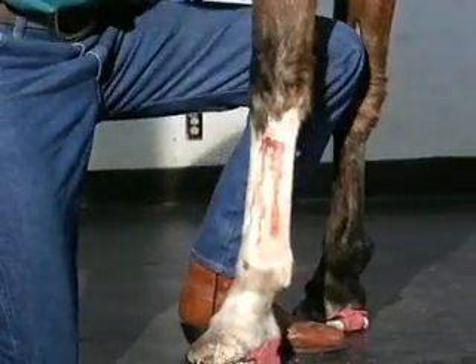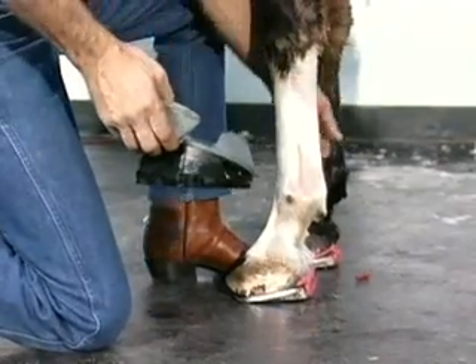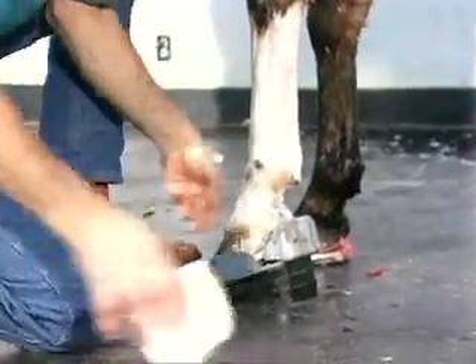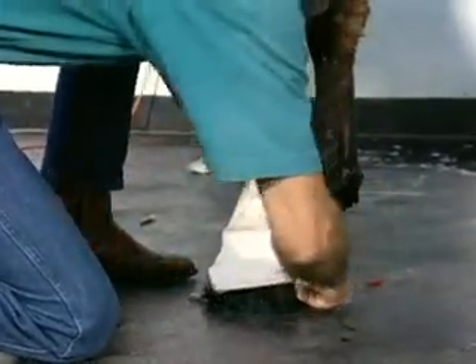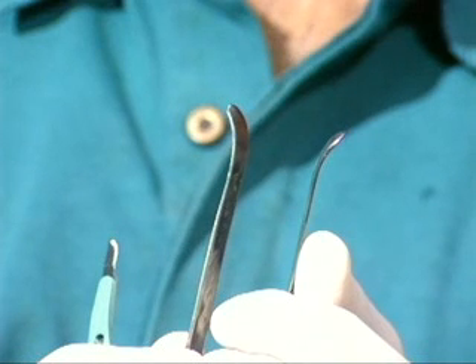Your results are very short-lived, and contractures and complications will always follow if you perform the deep flexor tenotomy without properly shoeing the animal. I can't stress this enough — the shoeing process is 90% of the results you want to get from this particular surgical procedure. Once I've blocked, I will place the foot in my regular Redden ultimate, which has three wedges. I'll just tape it on. This allows me to get my retractors between the deep and the superficial flexors, because this amount of elevation will make the deep flexor very laxed.